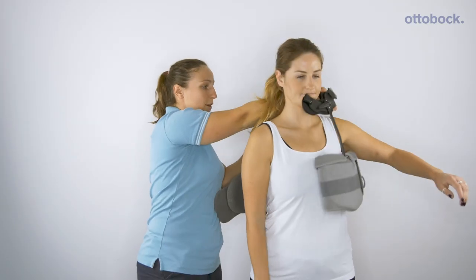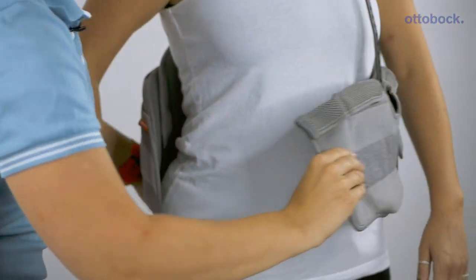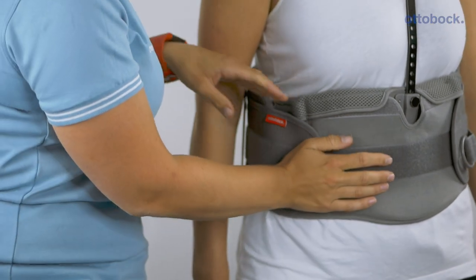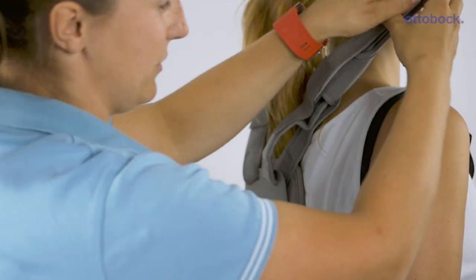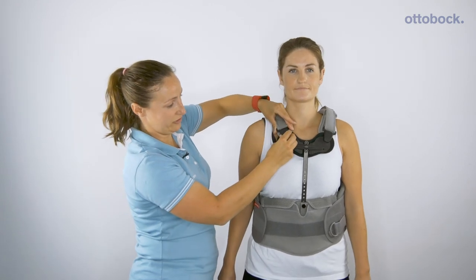Pop one arm through there. It's a simple fastening — one velcro strap here.